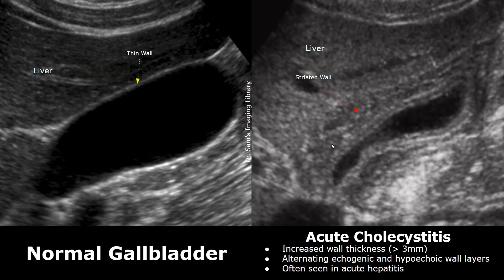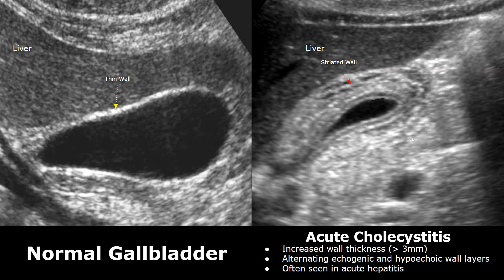This type of gallbladder appearance may be seen in patients suffering from acute hepatitis. The gallbladder wall has a striated pattern with alternating hypoechoic and hyperechoic wall layers. The gallbladder wall appears very thick. This is acute cholecystitis due to acute hepatitis. Here is another image showing a striated appearance of the gallbladder wall — a thickened, multilayered appearance. This was also due to acute hepatitis.